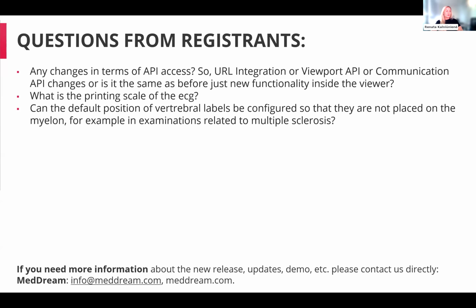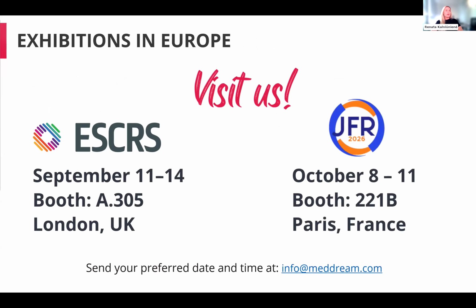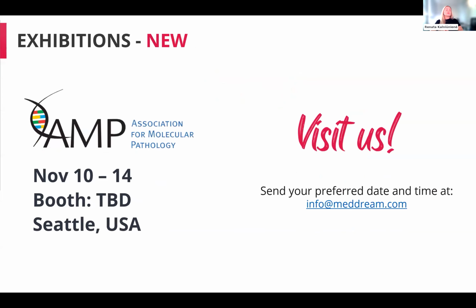Yes, thank you, Raimundas. Just a second, I'm going back to the slide. Also, we are going to have a new exhibition related to our new release and MedDream supporting pathology. The MedDream team is going this autumn, in November, to the AMP exhibition in the USA, the Association for Molecular Pathology show.